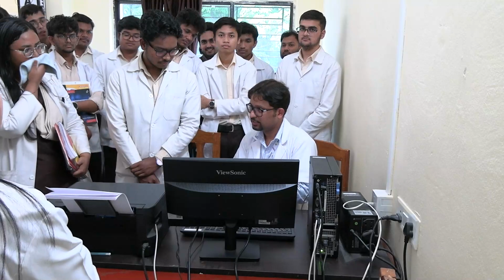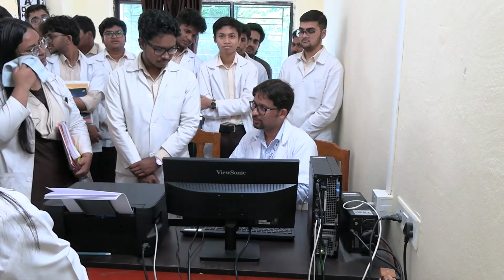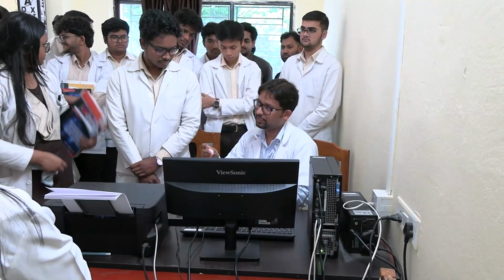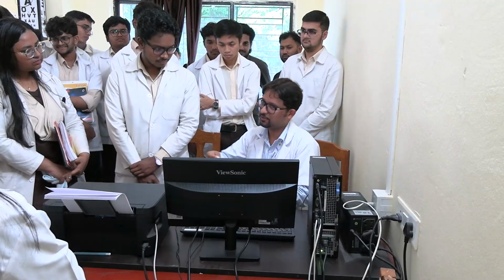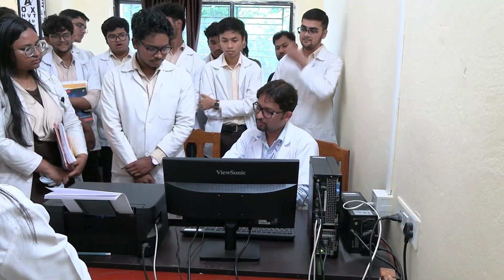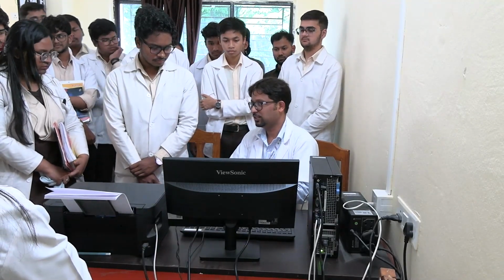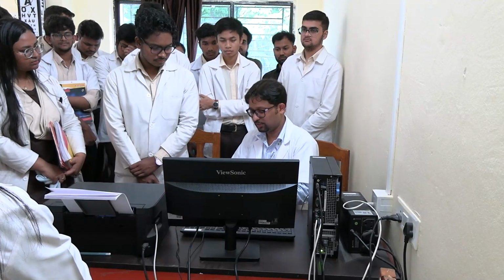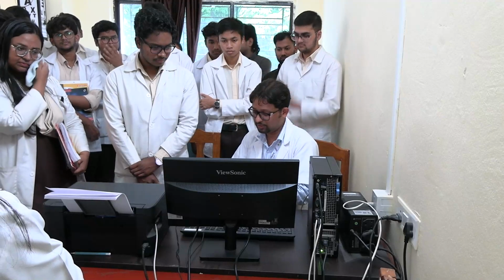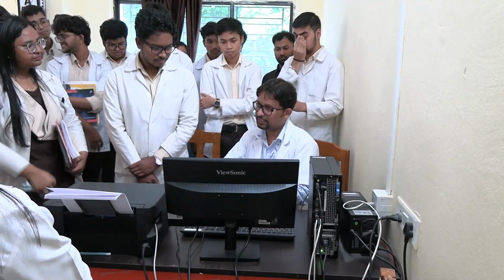And after exhalation, you have done exhalation in the mouthpiece, without stopping you have to inspire from the device again. So first we did inhalation with the nose, maximum inhalation, followed by exhalation into the device, and then followed by inhalation from the device again, this time again with our mouth, right? So this is how it is going to be done. Whenever you are performing the procedure, the mouthpiece has to be inserted fully within the mouth or oral cavity, and the lips should be sealed tightly so that air is not leaking.